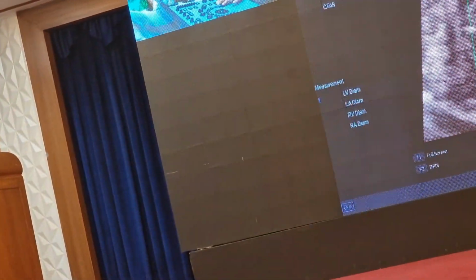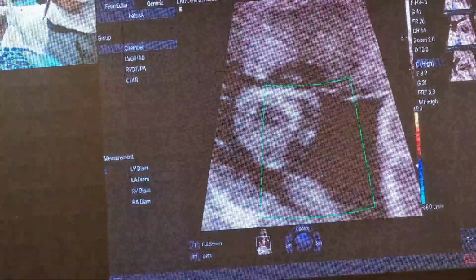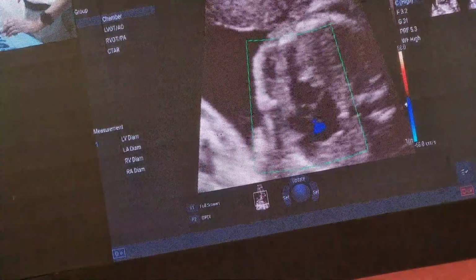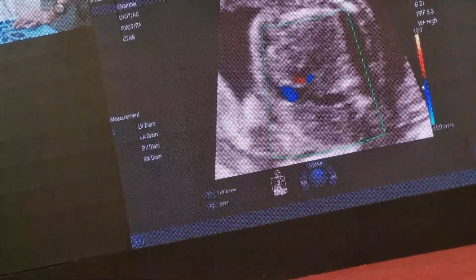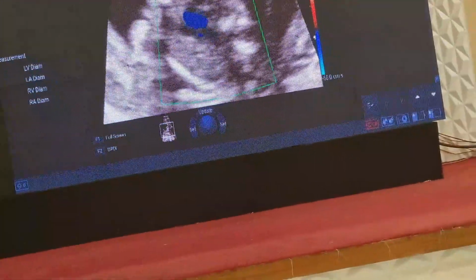The ductal arch is an arch where, normally, the pulmonary artery as it comes out actually trifurcates into the right and left pulmonary arteries and a ductal arch. The ductal arch continues and joins, and continues into the aorta. Why does that happen? Because we want to bypass the lungs, which are not yet mature. They are not able to take up the blood. So this is how it is.